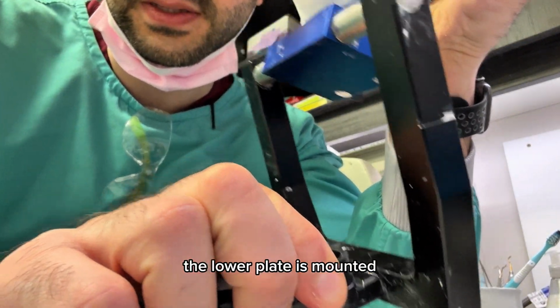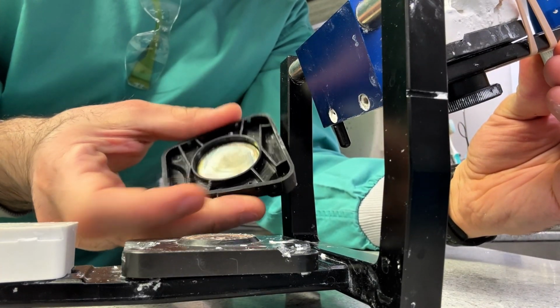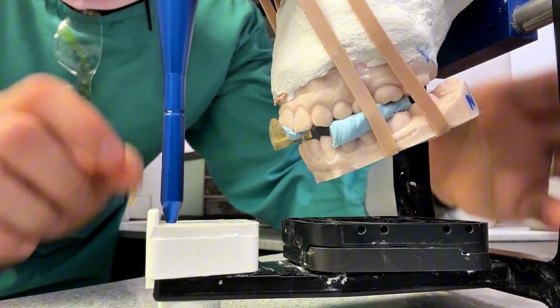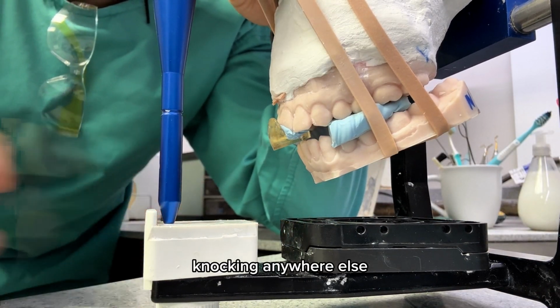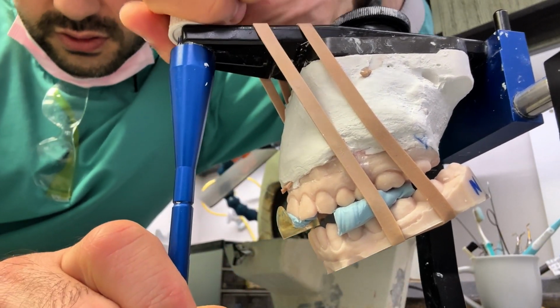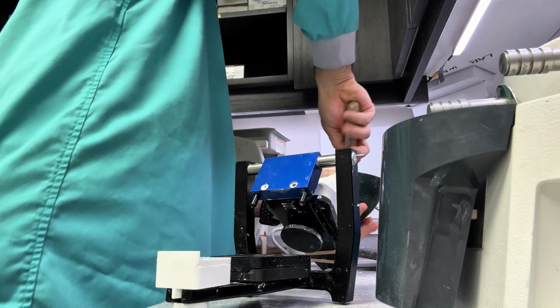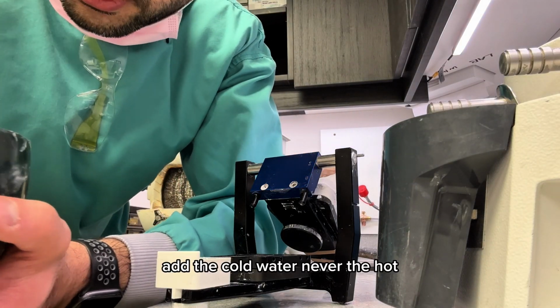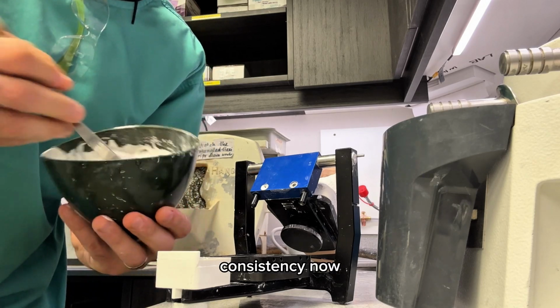The lower plate is mounted, and making sure it does close. And making sure the pin hits the base, not hitting anywhere else. If you are not hitting the base, you adjust it over here on this little one. Add the cold water, never the hot. My consistency now.